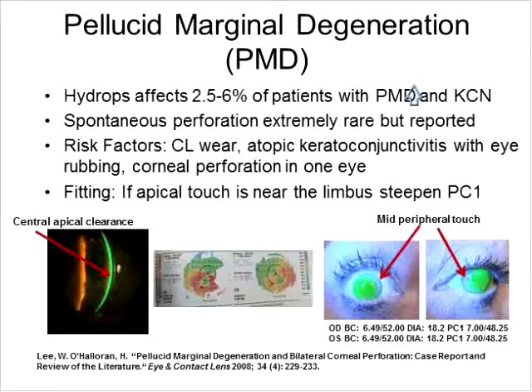When you have a dry eye patient, I believe it's better to have a little less tear reservoir than more, because less debris will accumulate underneath the lens. So if you think of the cornea as having about 500 microns and an acceptable amount of tear reservoir is somewhere between 150 and 400, so either the thickness of the cornea or a little bit less, you'll want to err on the lesser side, about maybe 150. And just make sure there aren't any areas of touch and that you do have complete clearance throughout the central curves.